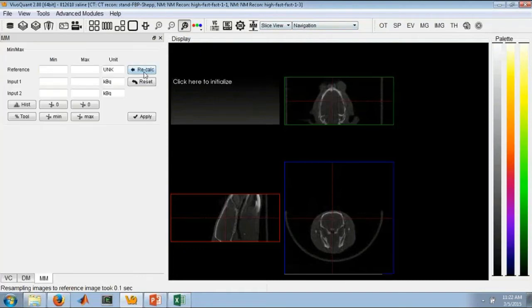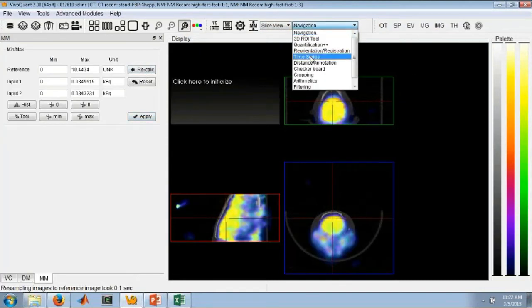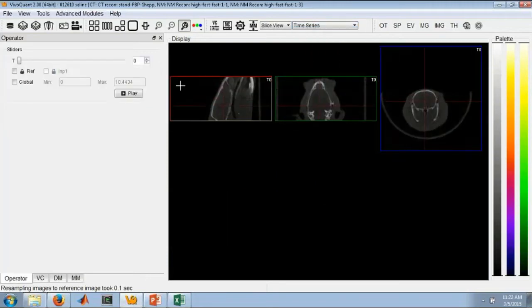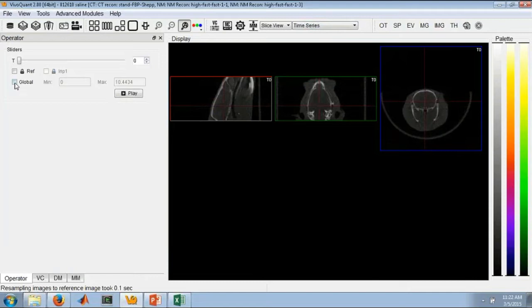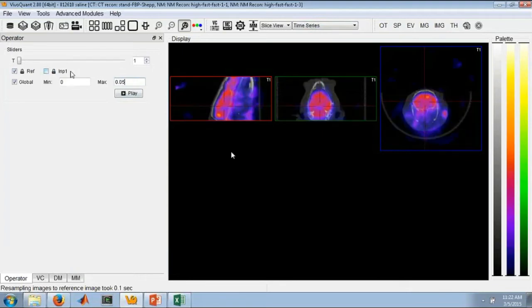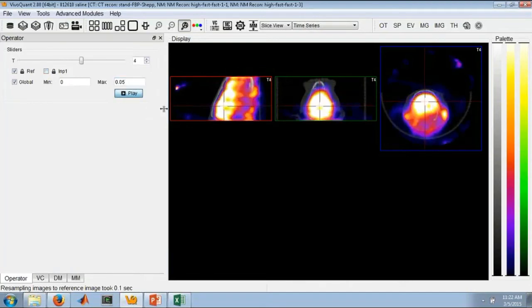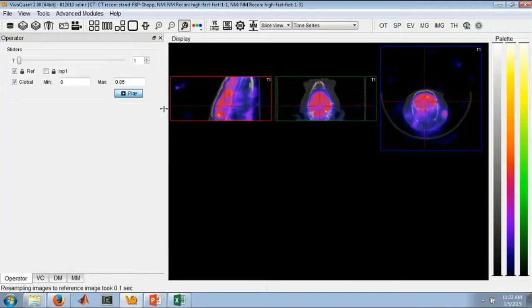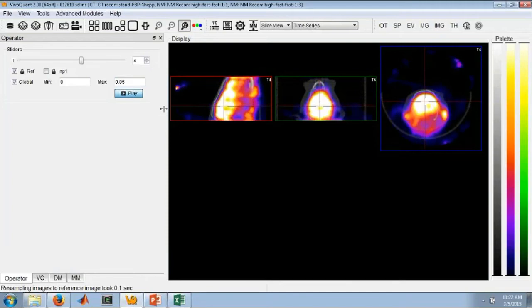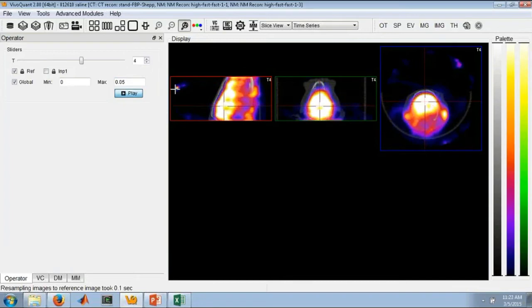Right off the bat, one thing that we have changed is in our time series tool. In the past, it was very difficult to view a time series if the scale of the data were different from frame to frame. We've now taken care of that with our global option. We can now set a global min-max, and it will maintain that global min-max throughout the data. So every frame is scaled the same way. You don't have to worry if you're visualizing something incorrectly.